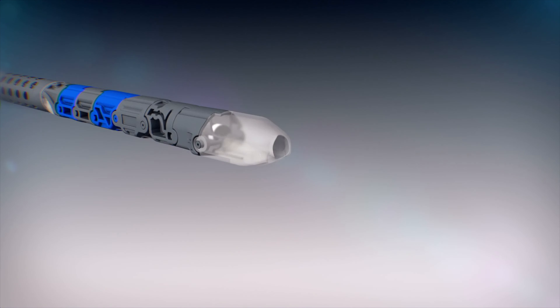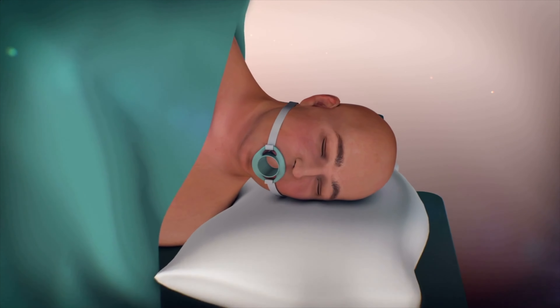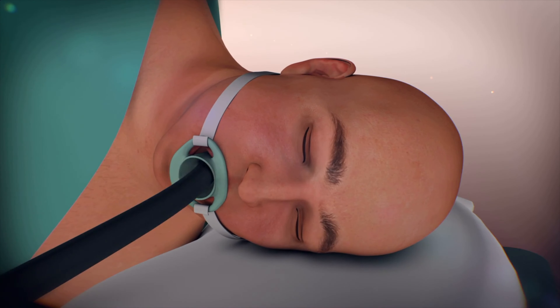There are several ways of performing TIF. The method shown here is via a device called EsophyX, made by Endogastric Solutions.